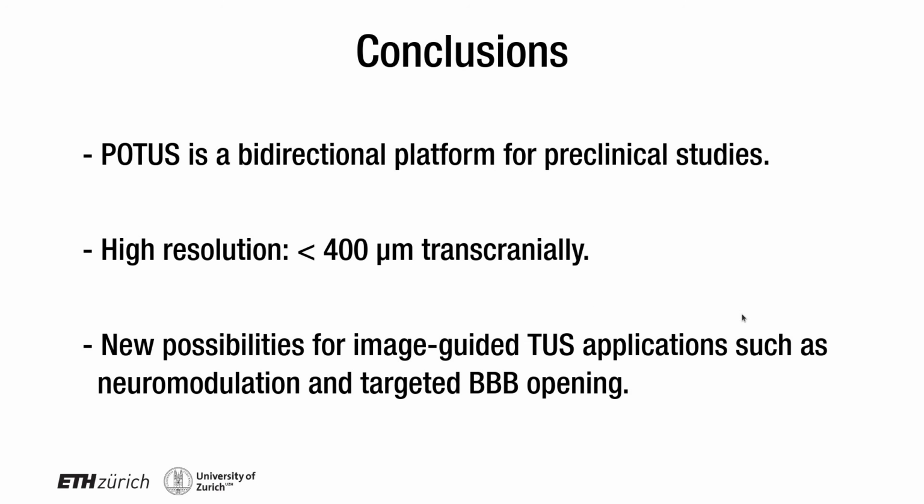So to conclude, POTUS is a bidirectional platform for preclinical studies. It has high resolution and it opens new possibilities for image-guided transcranial ultrasound applications such as neuromodulation and targeted BBB opening.